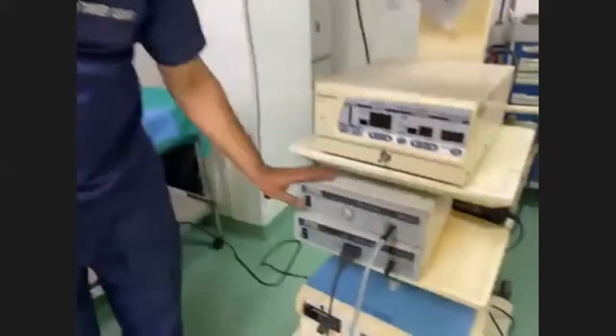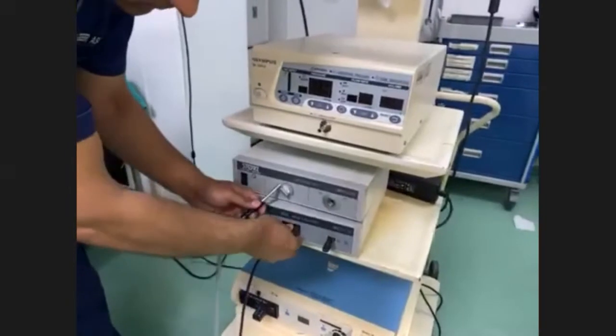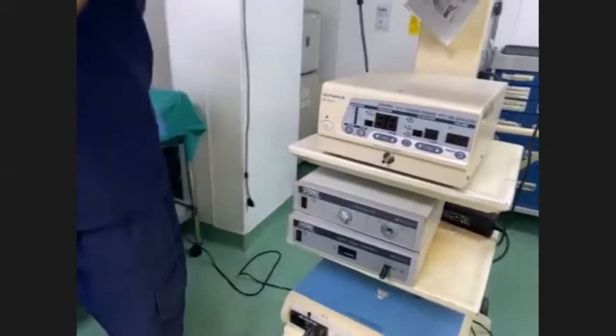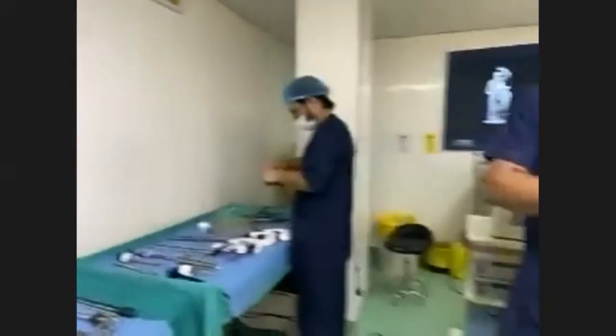Okay, sorry. So you can have a recording button here, and when you want to take a picture, just click it once and it will be stopped, right? Now at the end, we will stop it like this and we will gently detach all the things so they can be secured. So this is about the lab stack. Now I would like all of you to ask any question regarding the graspers, regarding the ports, regarding the patient positioning, or the lab stack.